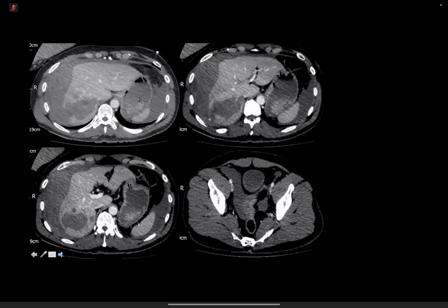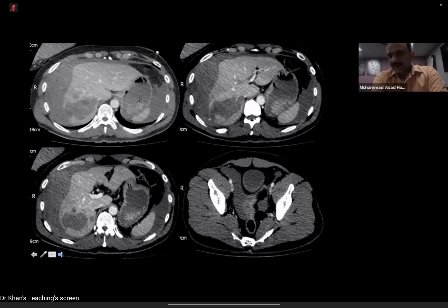It's mostly a ruptured tumor. Very well done. This patient is only 37, but yes, the tumors can rapidly grow in size and can rupture. So this is the patient who presented to our A&E, no history of trauma. CT scan was done, extravasation was noted, and as you rightly said, notifying the concerning clinical team and also asking them to contact the interventional radiology.